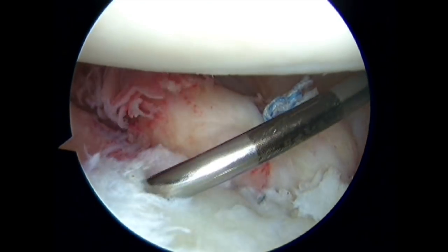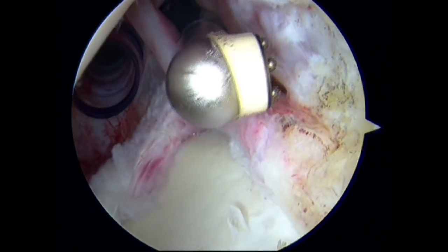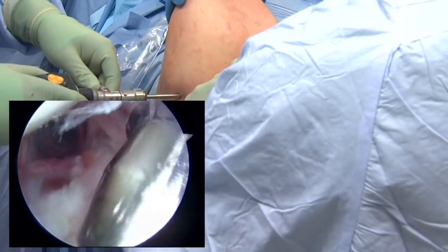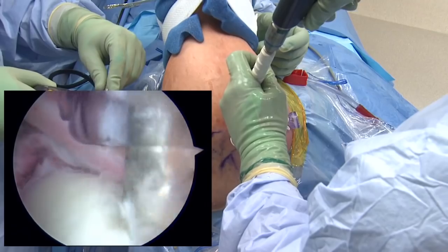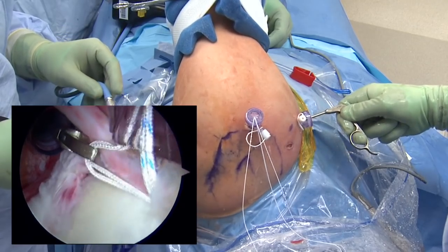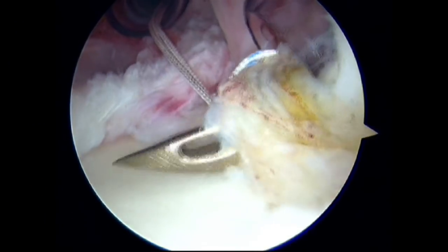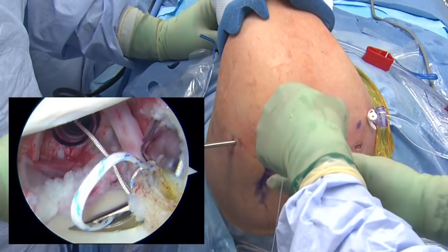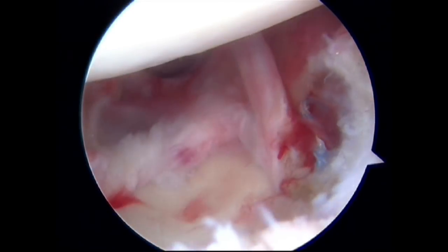Three anchors will suffice to stabilize this shoulder. Because this gentleman has a SLAP tear above, we're going to put one anchor through the junction of the supraspinatus tendon, down into the superior glenoid rim. We still have two cannulas in place, giving us flexibility, and we have two sutures so we can double if we want. We move the white sutures out of the way through the anterior cannula, then come down the cannula through the labrum with our bird's beak. With our other cannula in place, we position the suture into the mouth of the bird's beak, pull it through, and tie down the colored suture to create fixation of the SLAP lesion with just one suture, which will be sufficient.